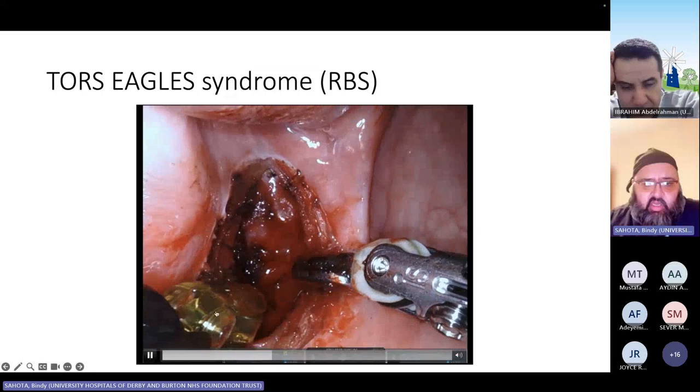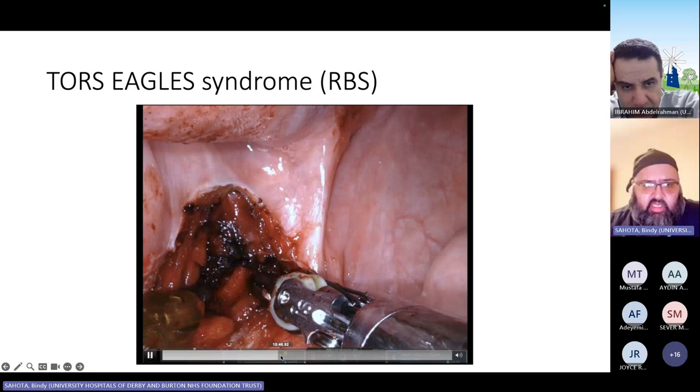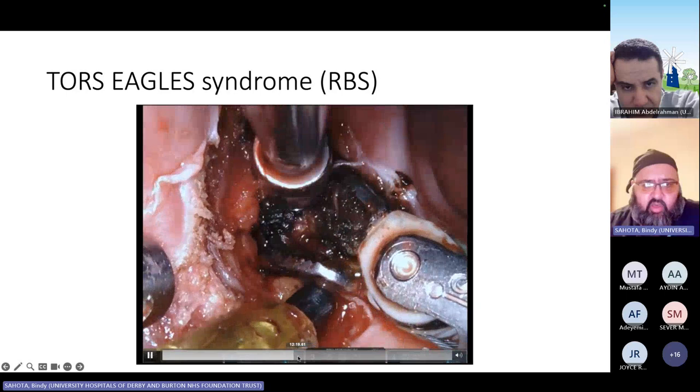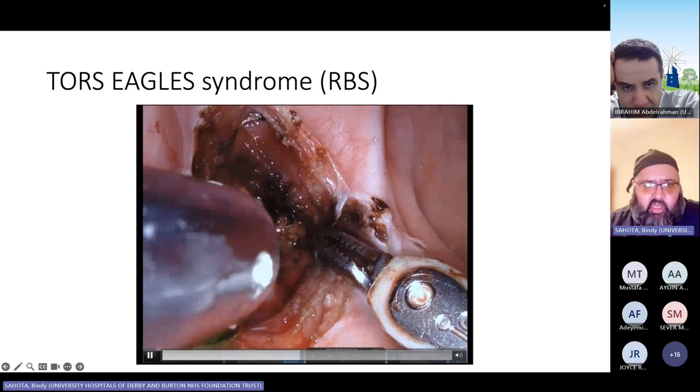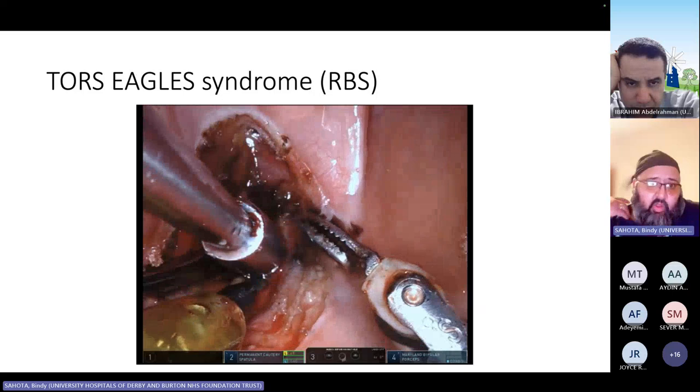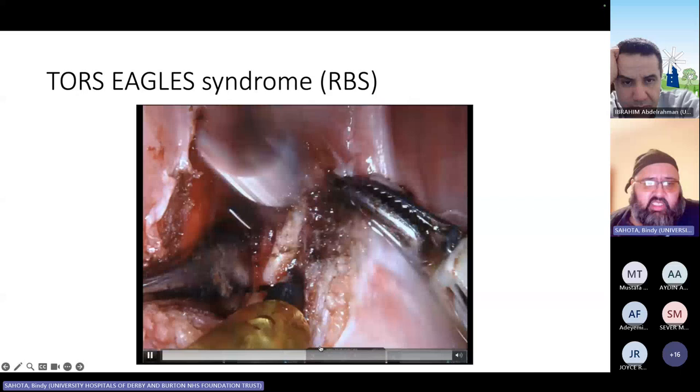By the time we get to here, you can see, just continue dissecting that, a bit of a wash to get it out, a quick change of the camera. Like I say, there's always blood vessels here. So they're always branches of the carotid directly. And then you can see the actual ligament right there. And that's what I'm cutting directly down onto. And you can see the mobilization above it. And you can see every time you let go, the tissue wants to flop back. So you mobilize this and you can see that entire ligament.